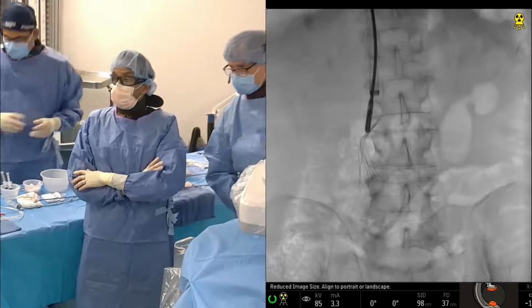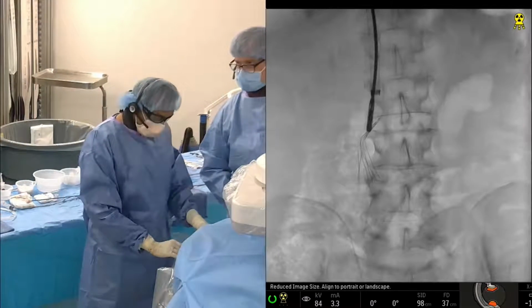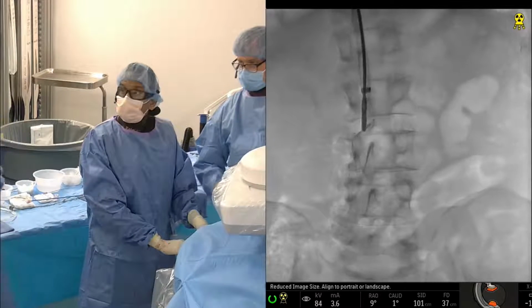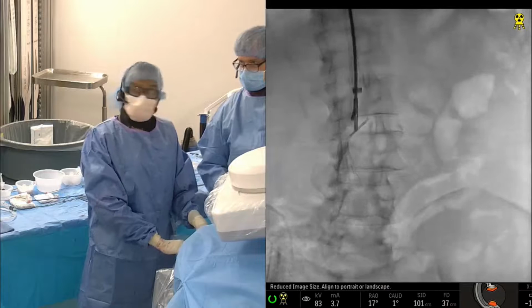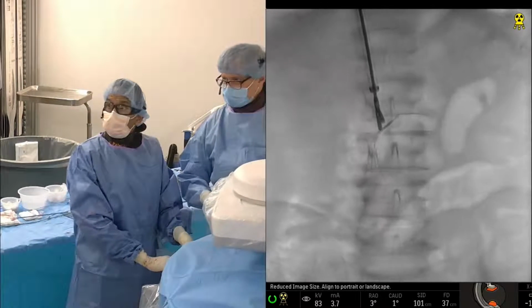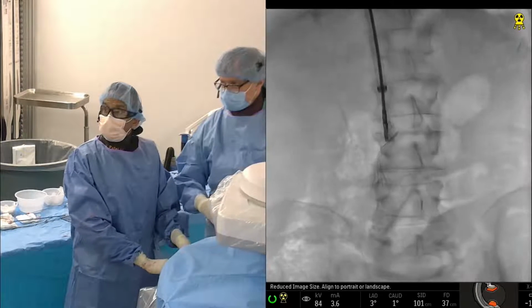So the trick is you will use both visual and tactile feedback. You're feeling for the metal, sort of clicking into the forceps, and you're trying to grab it the other way. So I'll go the other way, Raj. Yeah. A little more. Okay.